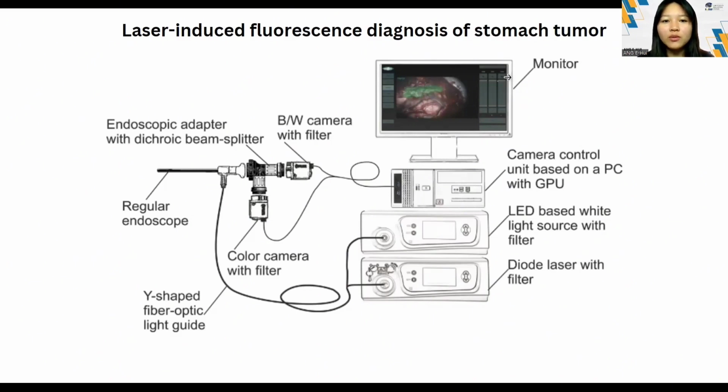Fluorescence signals were excited by a laser with a wavelength of 632.8 nanometers and detected by a spectrometer or a camera. Their fluorescent intensities and contrast were used to identify and differentiate tumorous tissue from normal tissue. The research also found that both systems were effective and provided optimal conditions for the diagnosis, such as the dose and timing of photosensitizer administration.